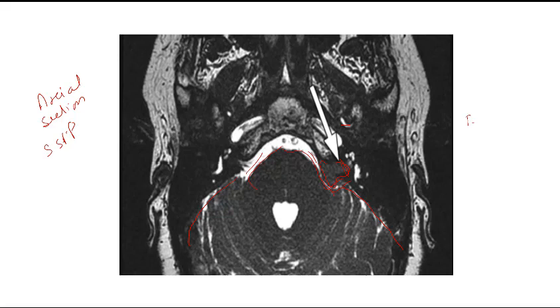As we know from the earlier slide, the 7th and 8th cranial nerves arise from the lateral part of the pons, go into the cerebellopontine angle, and then finally go to the porus acousticus. But due to the presence of these masses, which can abut these nerves, or even compress them, it's very important to see the relation of these nerves with the masses. It gives a clue to the surgeon on how to plan the surgery, or what kind of surgery they should plan for the treatment of the patient.